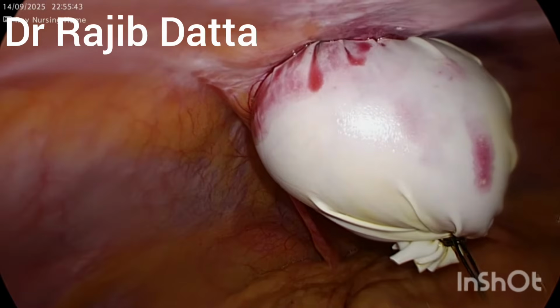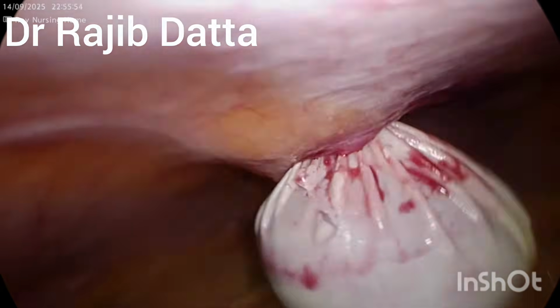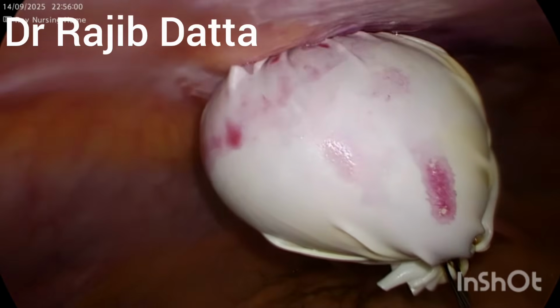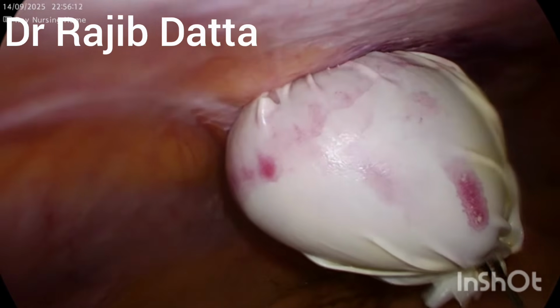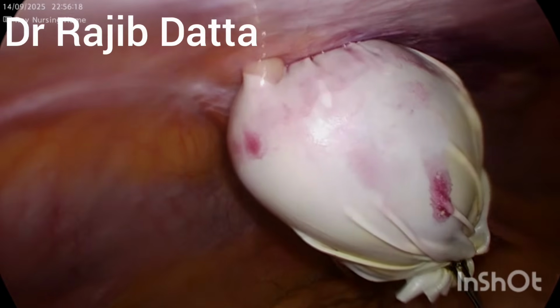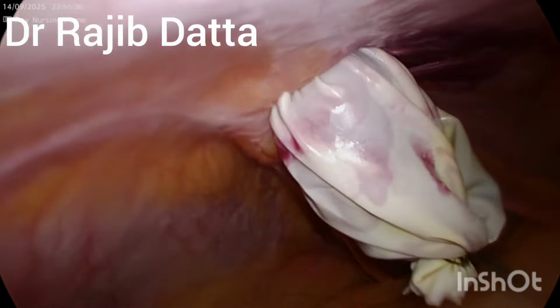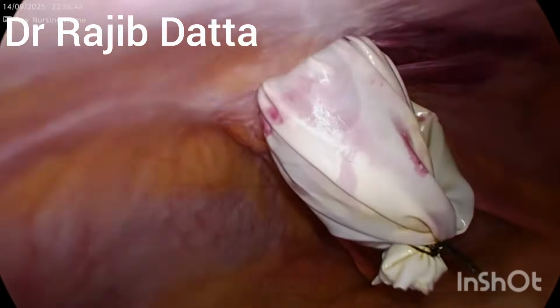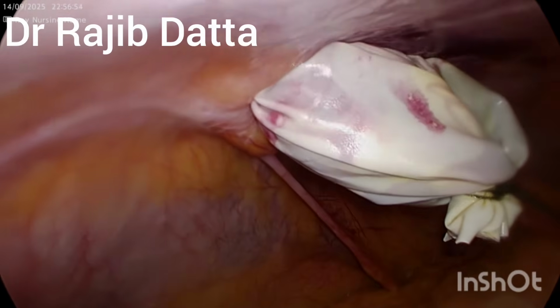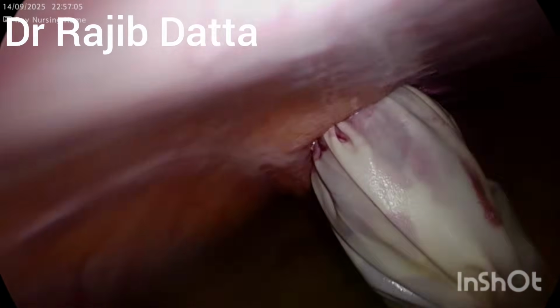Sometimes due to a thick walled gallbladder along with large stones, multiple large stones, this kind of problem is created. It is very difficult to retrieve the gallbladder sometimes from the port side. In that case, I prefer to always crush those stones, but if not possible, only then I will take out those stones after dilating the tract. So sucking the gallbladder along with its biliary content with the help of the sucker.